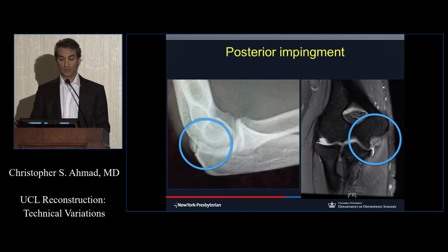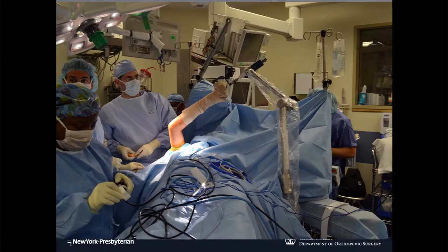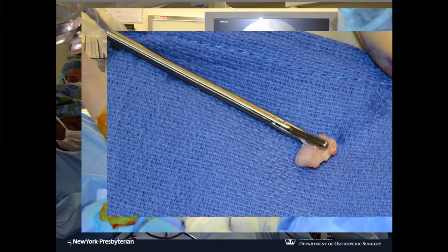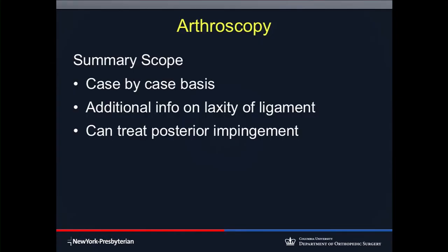You take that loose thing out in the back that we heard about and they got a ligament. This is what it looks like if you're going to do this. You can do it in a lateral, supine. This happens to be supine because we're going to do a ligament afterwards. You suspend the arm, you put the camera in. You can take the loose piece out, and then you can go and convert to your open approach, very easily put it on a hand table and do your reconstruction.